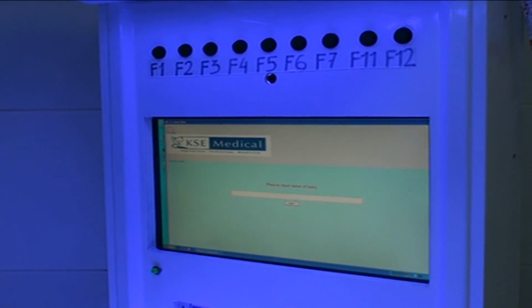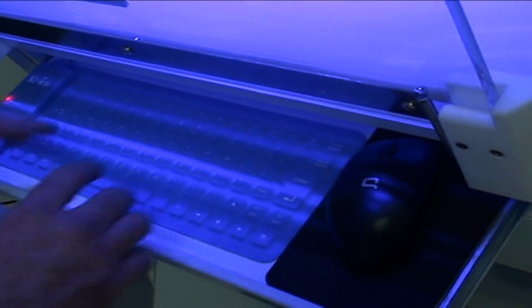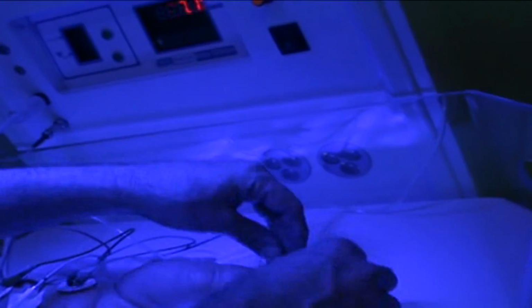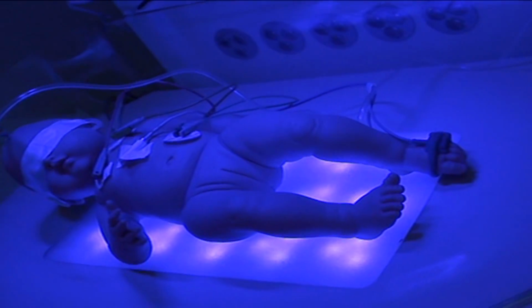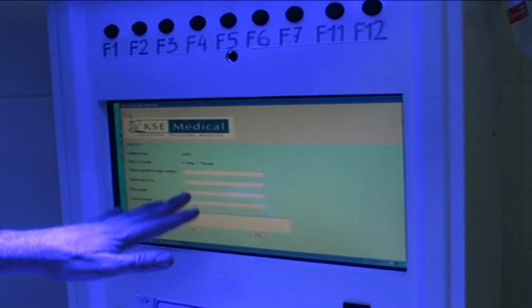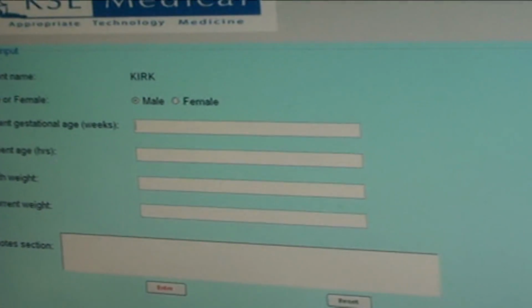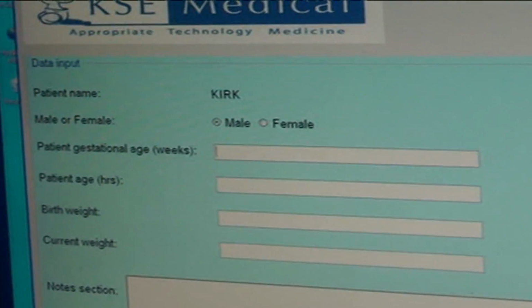So when the doctor comes up with the new baby, they will input the patient's name at the keyboard, then press enter. Then it tells you to connect sensors to the baby. The doctor will connect all the sensors to the baby. When that's finished, they press enter to continue. Then, while the sensors and machine are stabilizing all the readings, the doctor can continue to put in all the data. This is all saved on the machine, and can be gotten by USB. All the patient data, all vitals are tracked, real-time data, nothing is lost.